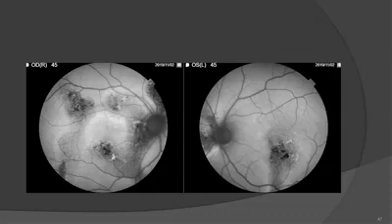No evidence-based, Dr. Abdulaziz. No evidence-based. Yes, but I agree with you. This is a very difficult case to diagnose, and maybe if you try all these micropulse lasers, you will get the same results. I usually try to dry the macula as much as I can in order to reduce the power of the laser and to be more effective.